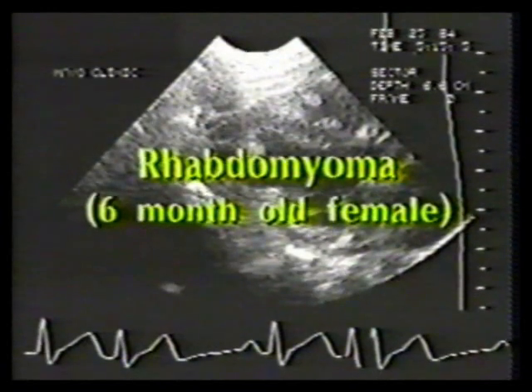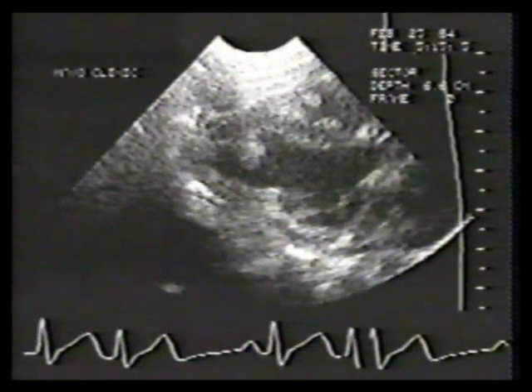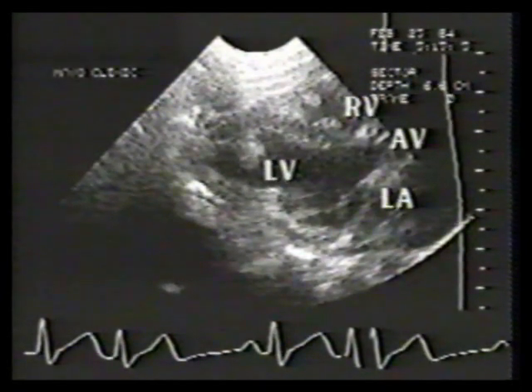This is a 6-month-old female with tuberous sclerosis and multiple cardiac rhabdomyomas. On the parasternal long-axis scan, there's a pedunculated tumor in the apex of the left ventricle and multiple tumors found in the right ventricular cavity.